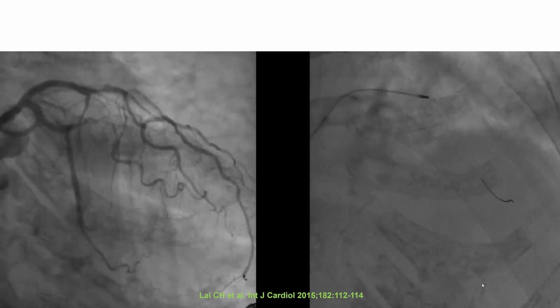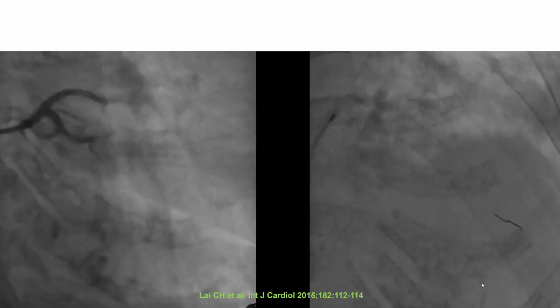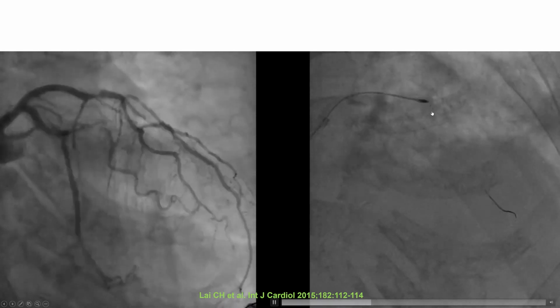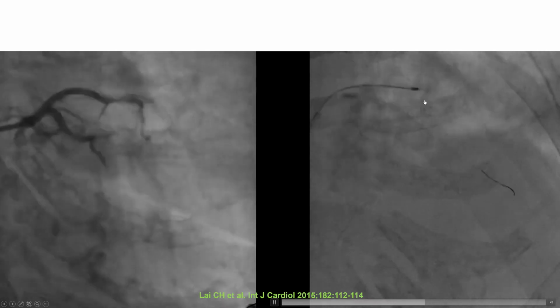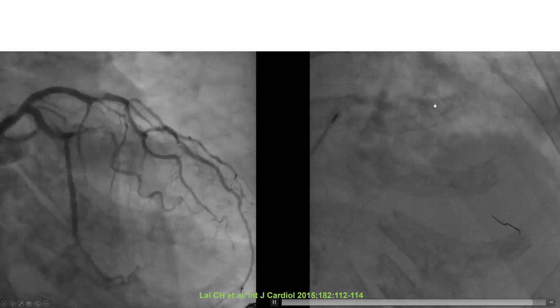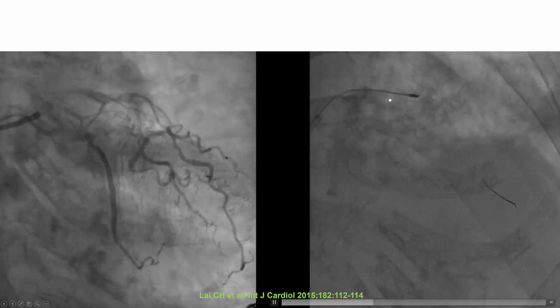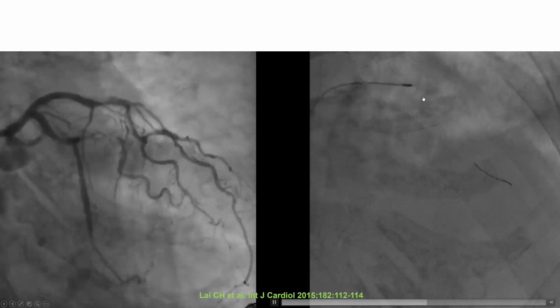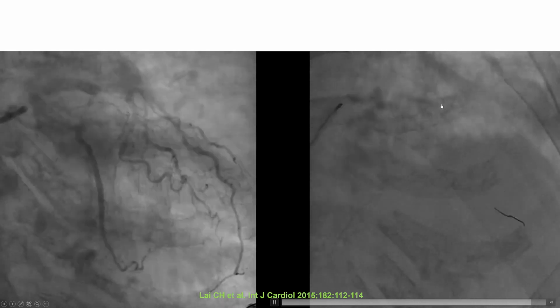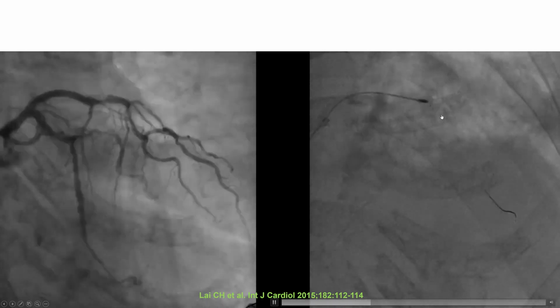This is a published case of rotational atherectomy that resulted in perforation. In the initial part, this is how rotational atherectomy should not be done, not having prolonged contact of the burr with the lesion. Eventually, in this case, it did yield. But ideally, what one wants to do is to have a pecking motion, a back and forth motion, similar to the second part of this video, back and forth motion with light and limited duration contact of the burr with the lesion.